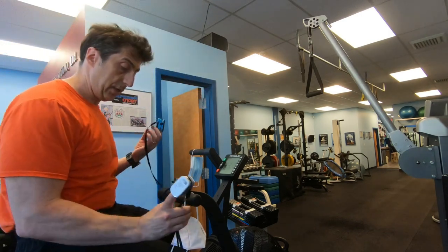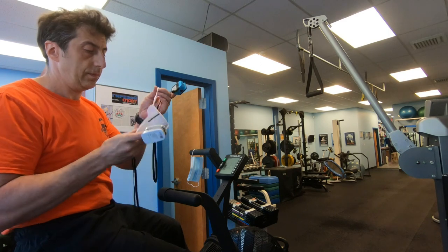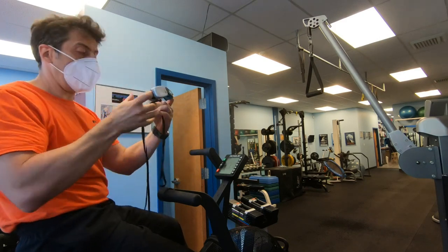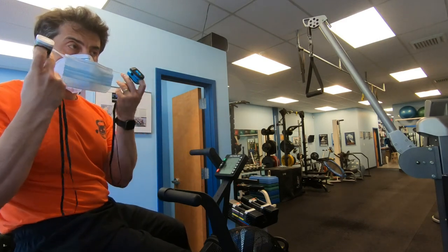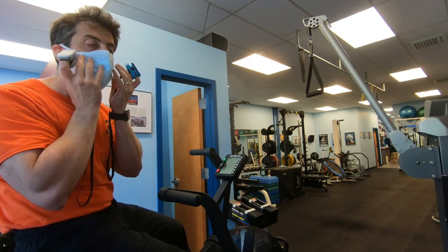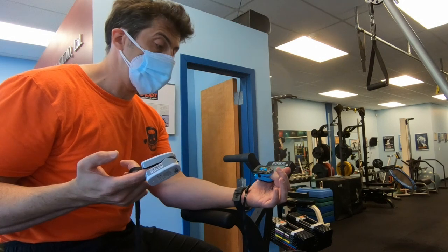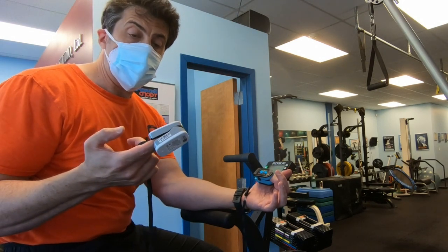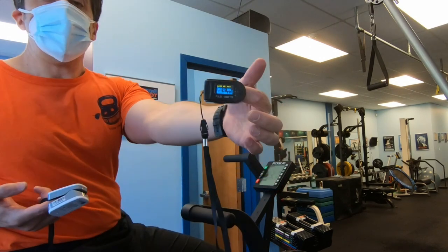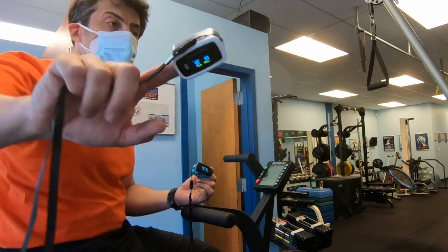So now I'm gonna put on a mask. I will actually put on two masks. One is an N95, and on top of that, I'll put a regular surgical mask. Now I'm wearing two masks and breathing through both is a little challenging, so we have to do a little forced inhaling and exhaling. So far my blood saturation didn't drop. It still shows 98 here and 97 here, so I'm still good.